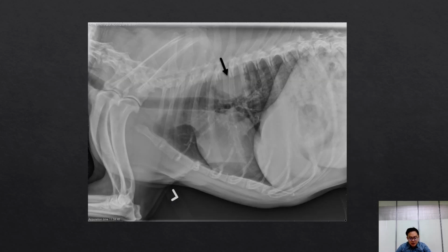Okay, someone brings their dog to the clinic. This dog has been coughing a lot and it's been getting worse recently. The clinician does radiographs and finds this huge tumor in the chest. So here's the heart, and here's where the lungs are located, and you can see that there is a mass in the chest. And this whole opacity is a pulmonary tumor. So immediately, even without involving the pathologist, we know there's almost certainly a tumor within the chest of this dog.